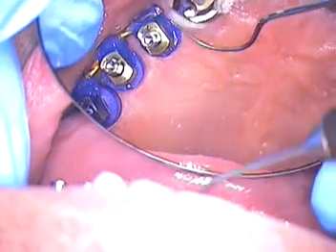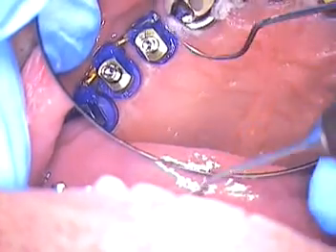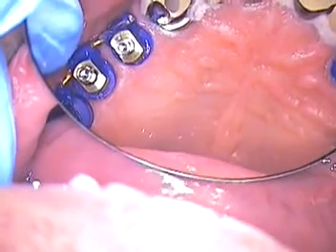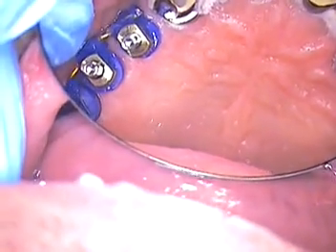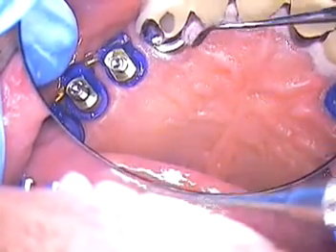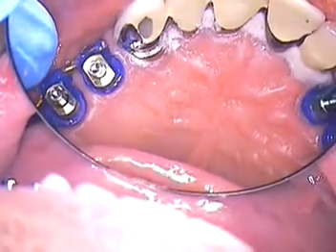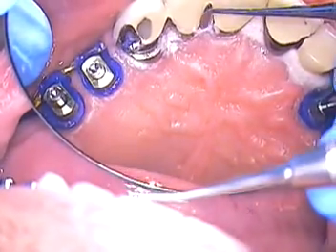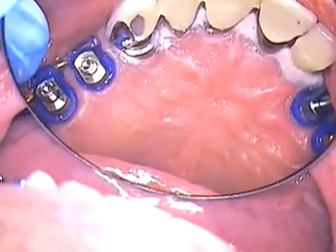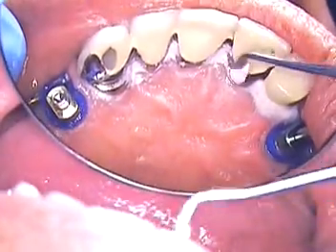Let me have a Hollenbeck, please. This is the Ultraden blockout material. I'm just taking some of the excess off, trying to be as neat as I can with this.